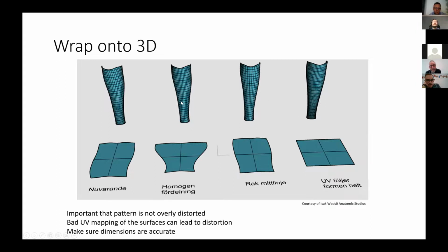So instead, we can use other approaches where, for instance, we re-trim the surface and we do some geometrical measurements on it to do the scaling, and align these curves with the center line of the covering. And this way, we can get a very uniform covering of these rectangles onto the covering. And this means that we get a better quality of the pattern in the end compared to the default way or the other sort of trivial way of creating these mappings here. And you can also see that there is quite a difference in how this shape looks like when it's flat.